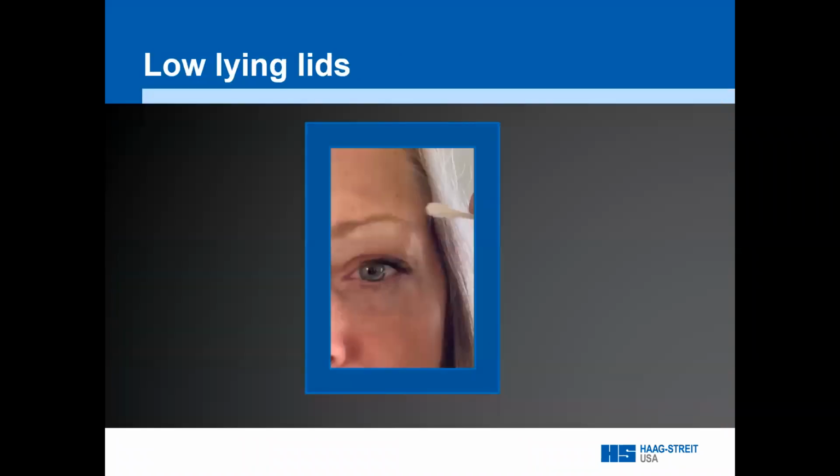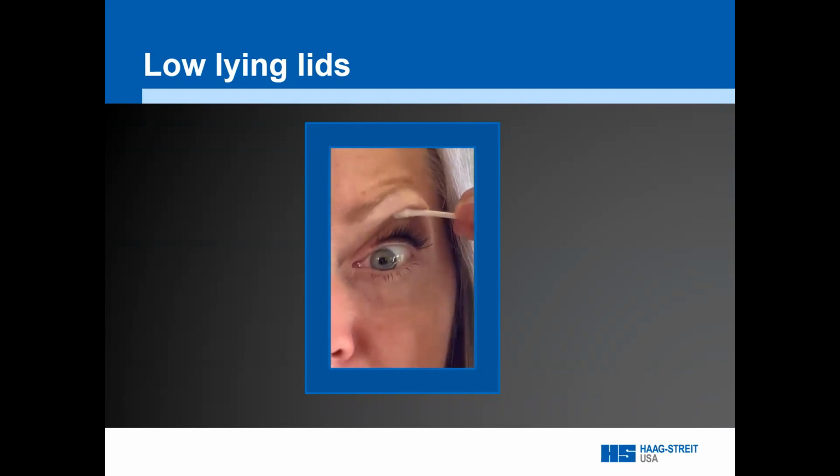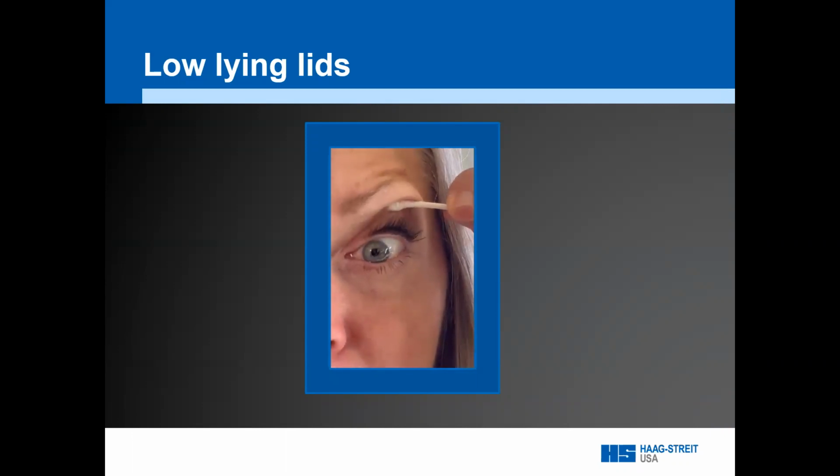By placing a cotton tip applicator on the brow bone, notice how effective rolling the lid skin up into the cotton tip applicator is to help open the palpebral fissure. I recommend allowing the patient to blink at first, then rolling the lid skin for the scan and unrolling to allow the patient to blink in between. The cotton tip applicator is very slender and avoids interfering with the Lenstar while measuring. If you do not have APS, you may need to have assistance with this technique.